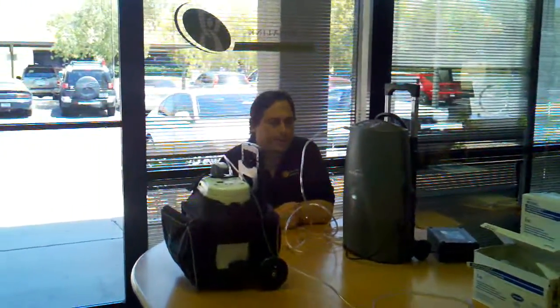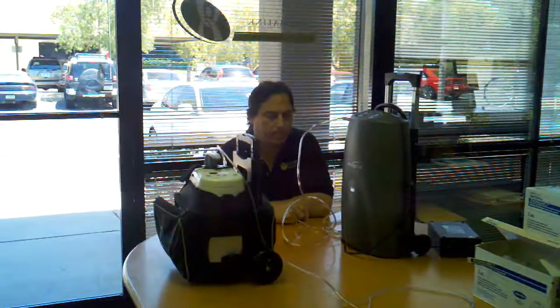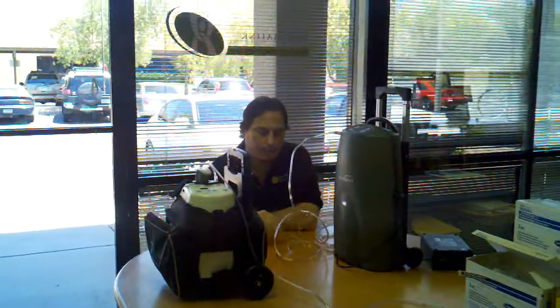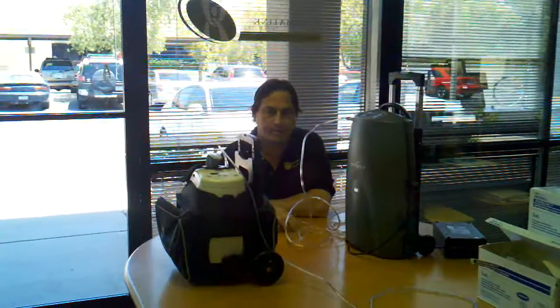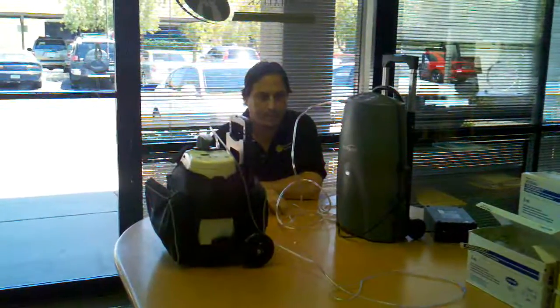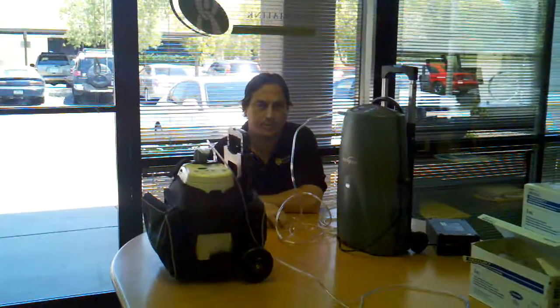Hi, my name is Robert Remitz. I'm going to be explaining how to purchase a portable oxygen concentrator on our website. This is very important. Our return policy says 15 days, but before you purchase a portable concentrator, you must understand the variables that you're up against. I'm going to explain how this works so that way you can make the right decision, because we only sell brand new portable oxygen concentrators straight from the manufacturer.